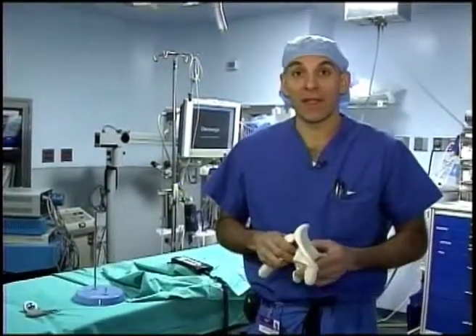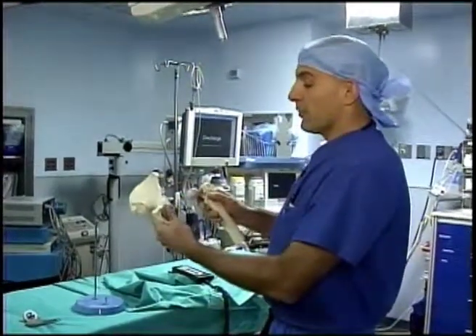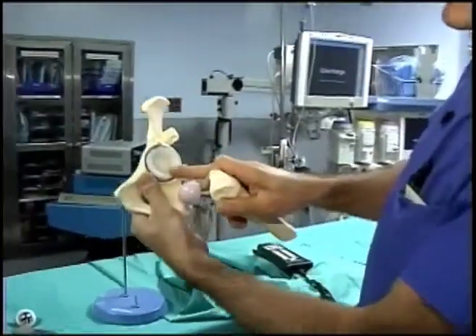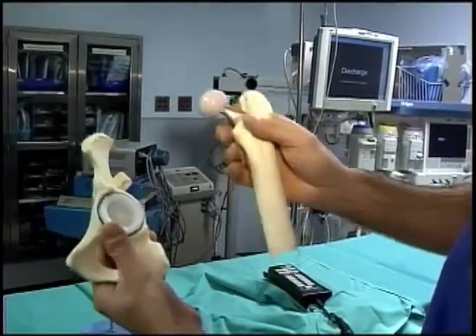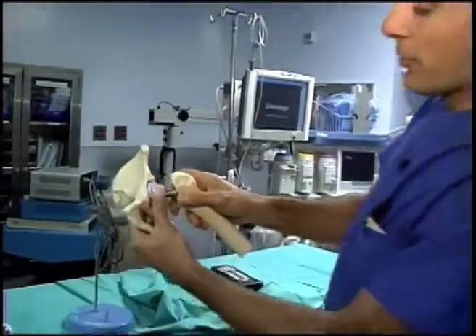Today we're going to be seeing a left hip replacement. In a hip replacement, what we're doing is replacing an arthritic hip with a metal and plastic prosthesis. This is a model of a pelvic bone, which has the acetabulum or the cup portion of a hip. This is the femur or the thigh bone, which has the stem and the ball portion. This shows a replaced hip where the ball fits into the socket, which we're going to see today in the operating room.